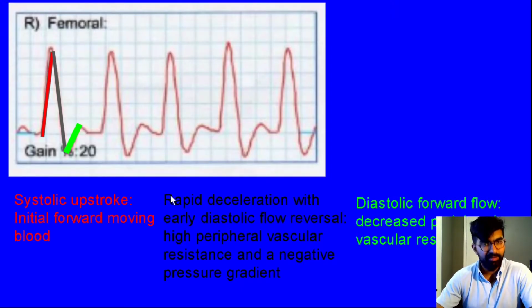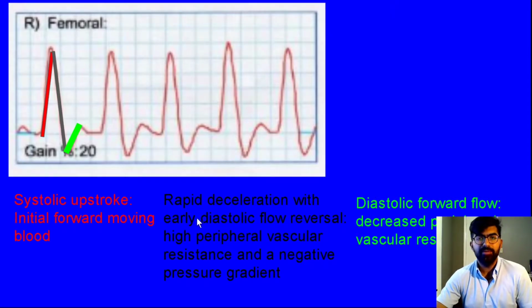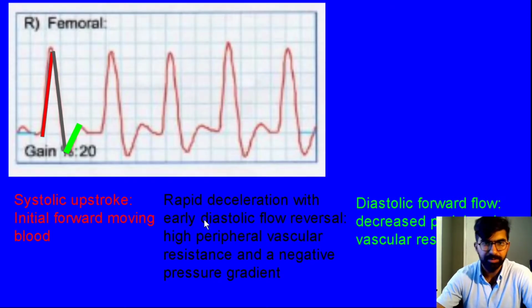And most of you have looked at this and said, yes, that looks normal because it's a triphasic waveform. And hopefully I'm going to start getting you to move away from those terms, because what you may find is that even a biphasic waveform is a very normal waveform in certain pathologies. And we'll understand that as we move a little bit forward. What you have right here is really the anatomy of this particular waveform.